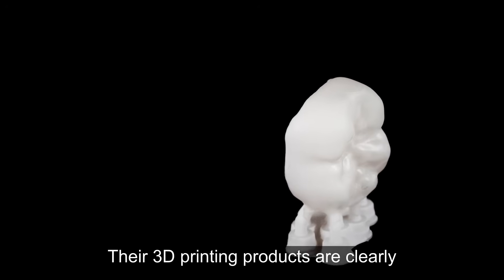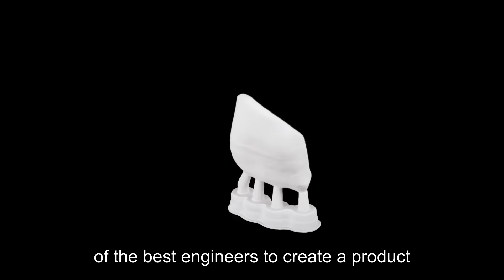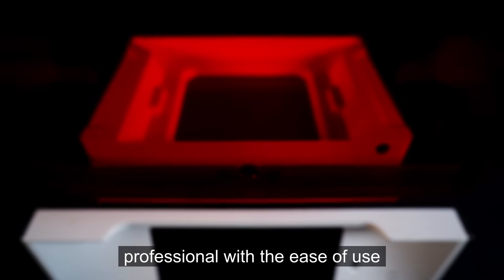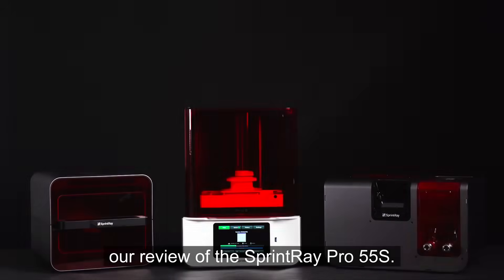Their 3D printing products are clearly born from the dental community. They collaborated with designers, world-class dental professionals, and some of the best engineers to create a product that is clearly designed for the dental professional, with ease of use for their team members to be able to implement. We're really excited to bring you our review of the Sprintray Pro 55S.